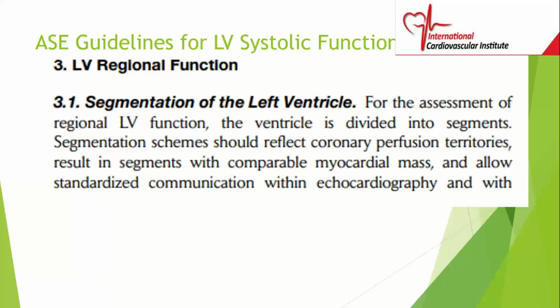So for the assessment of regional LV function, the ventricle is divided into segments. Segmentation schemes should reflect coronary perfusion territories. So one of the main reasons for looking at the heart in segments is because of the blood flow. We can relate the blood flow to the different segments.